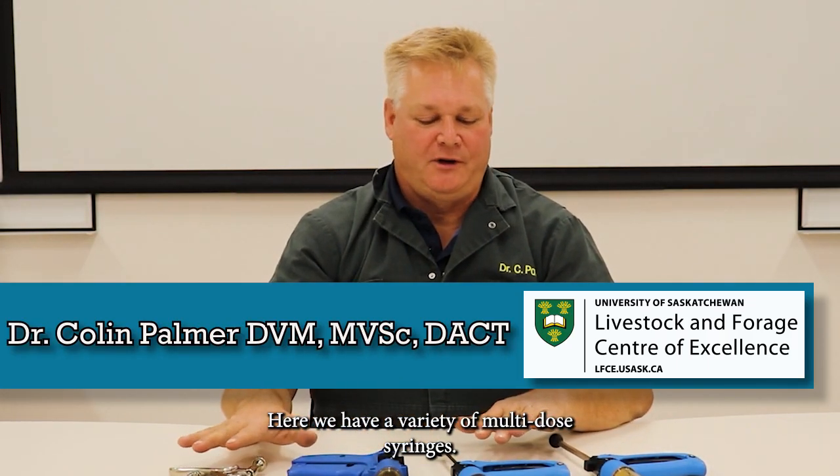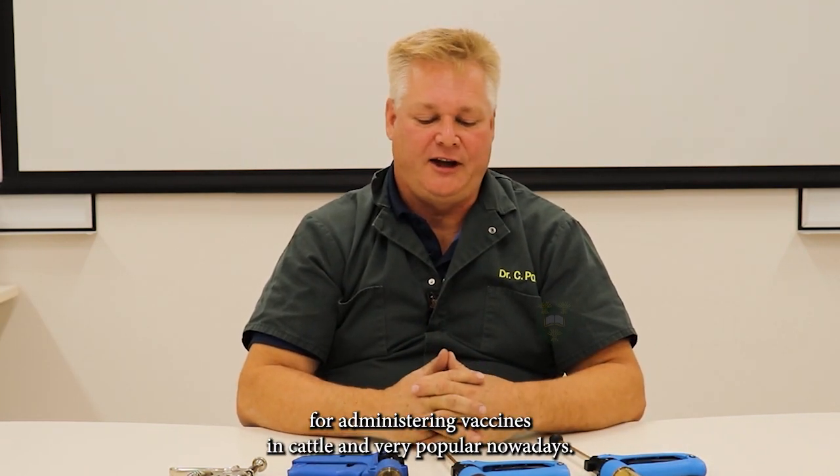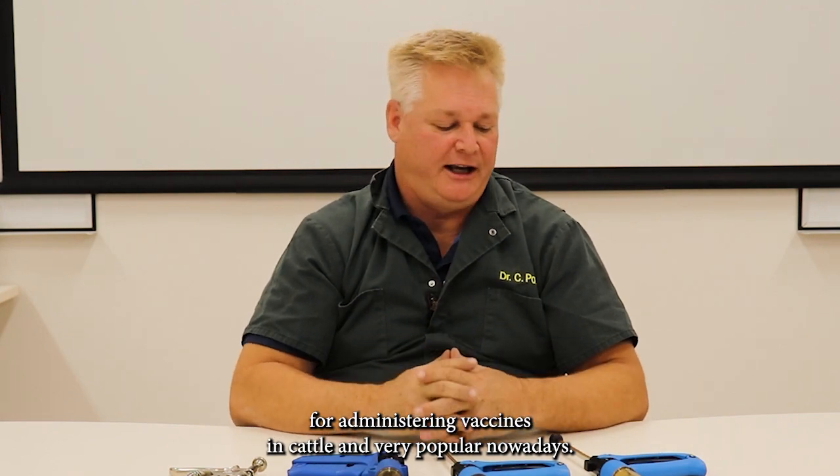Here we have a variety of multi-dose syringes, all of the 50cc quantity. These are very useful for administering vaccines in cattle and are very popular nowadays.